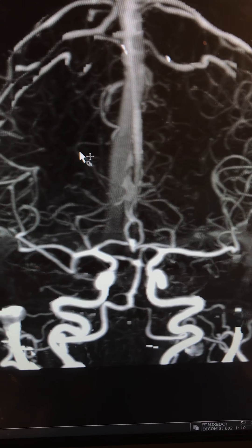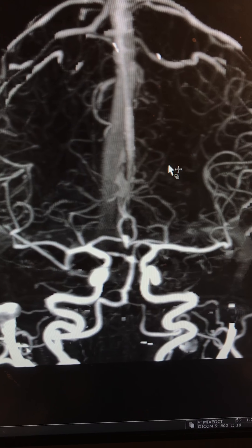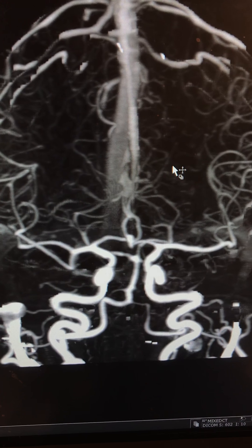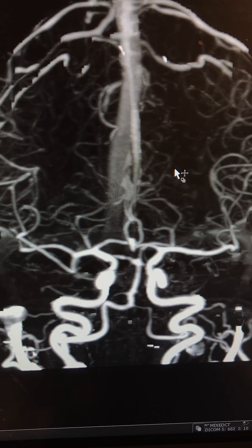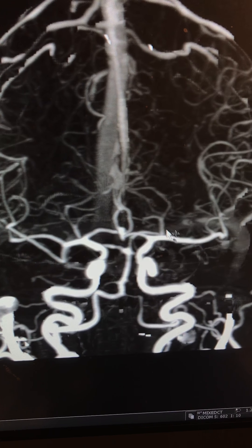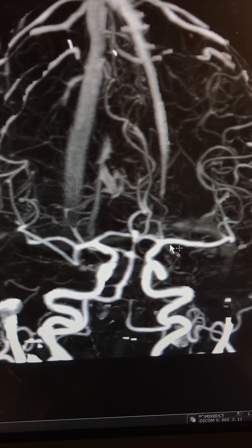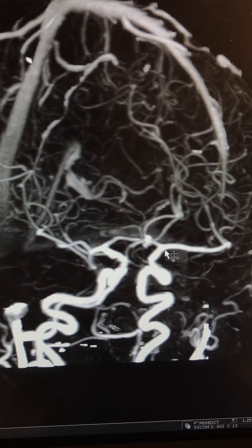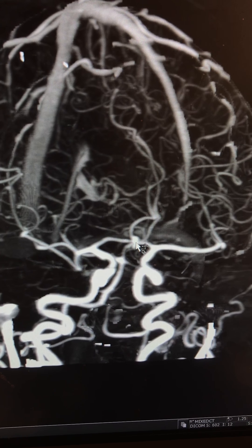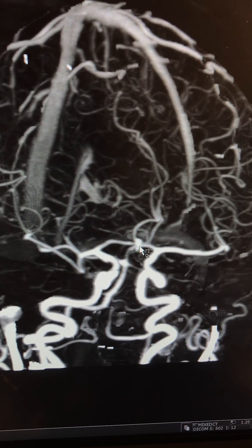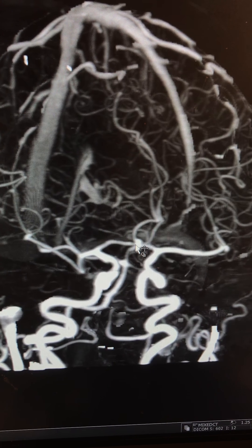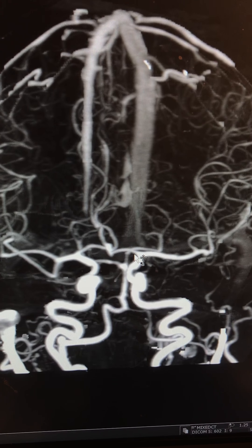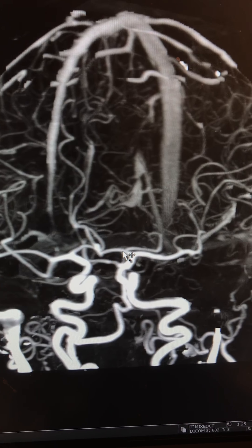This is a 64-year-old patient who presented two weeks earlier with significant subarachnoid hemorrhage and was referred to us with a suspected anterior communicating artery aneurysm. This was confirmed on a CT angiogram done one day before the procedure, which showed a reasonably wide-neck aneurysm at the anterior communicating artery level.